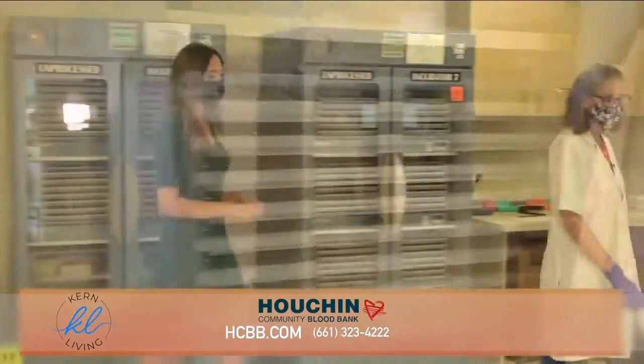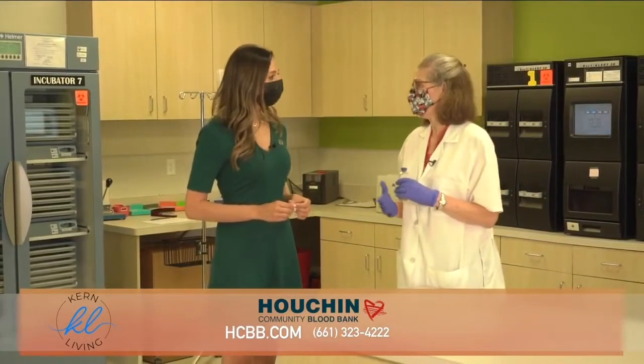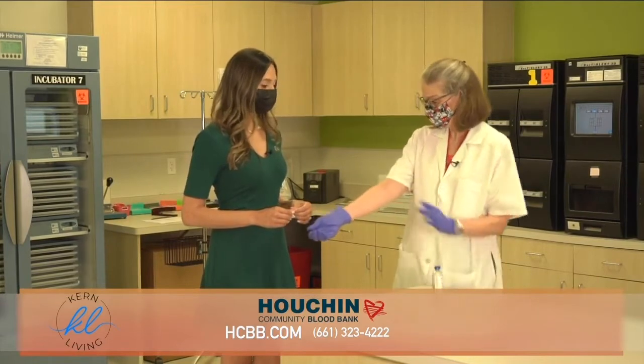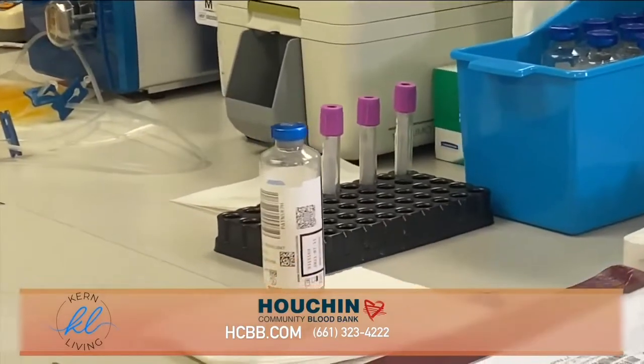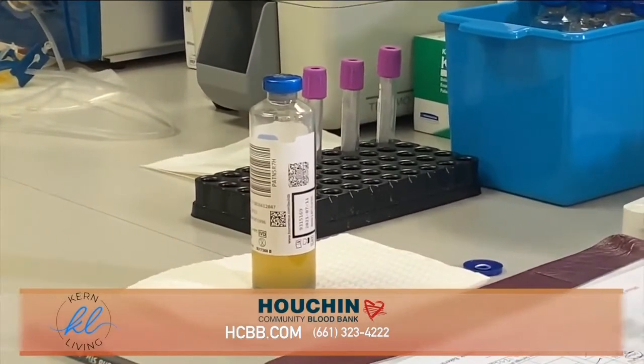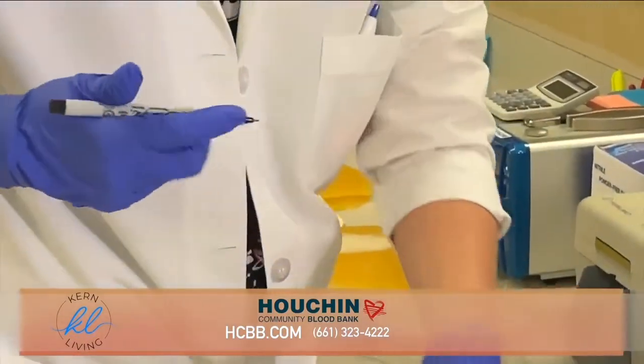We perform a platelet culture, Jessica. Platelets normally do not have bacteria in them, but 1 in 5,000 platelets will be contaminated with bacteria. That can either be from the skin of the donor, or it can be that the donor was sick and had bacteria in their blood. And so that can be very critical and dangerous to the transfusion recipient and often fatal. So we perform a culture and we use these bottles that have media in them with nutrients that the bacteria can metabolize. They give off CO2, which causes a colorimetric change on the bottom of the bottle.